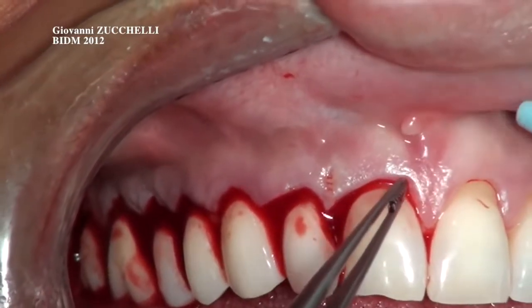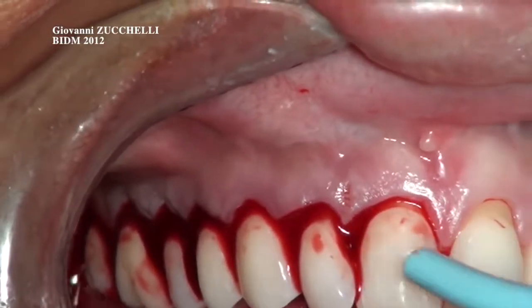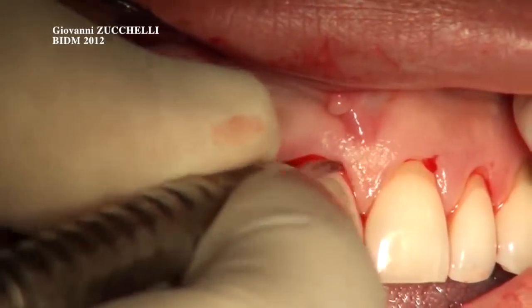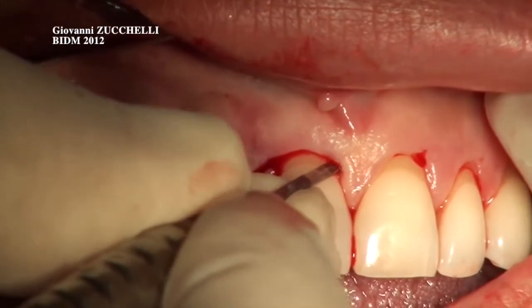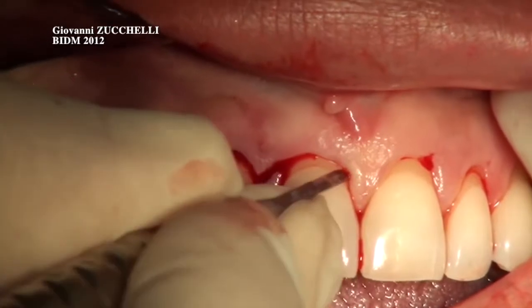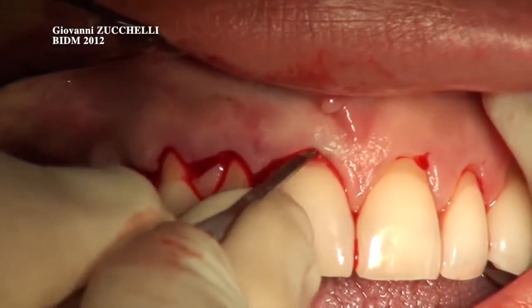It means that you have to get your papilla free from muscles, even without elevating it even more mesial. So please give me the small knife. Deep incision here. Deep incision in order to remove muscles.